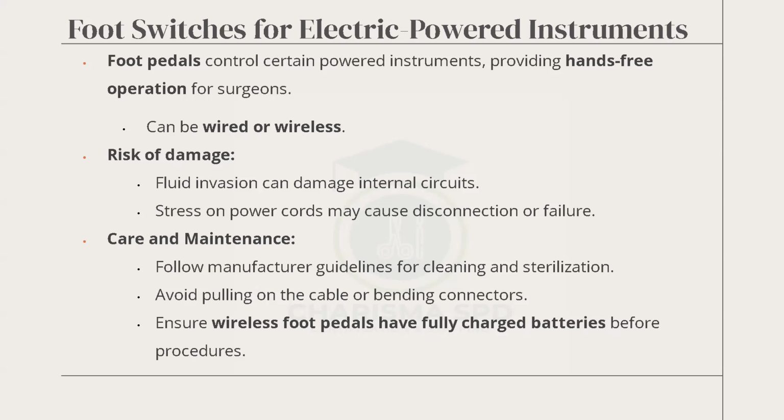If not, in the middle of the case the machine goes out, and we are in trouble. You have to panic, pressing the panic button, calling other locations, trying to get one, because some of these take like 5 hours to charge. That's why you have to charge it the day before the surgery.